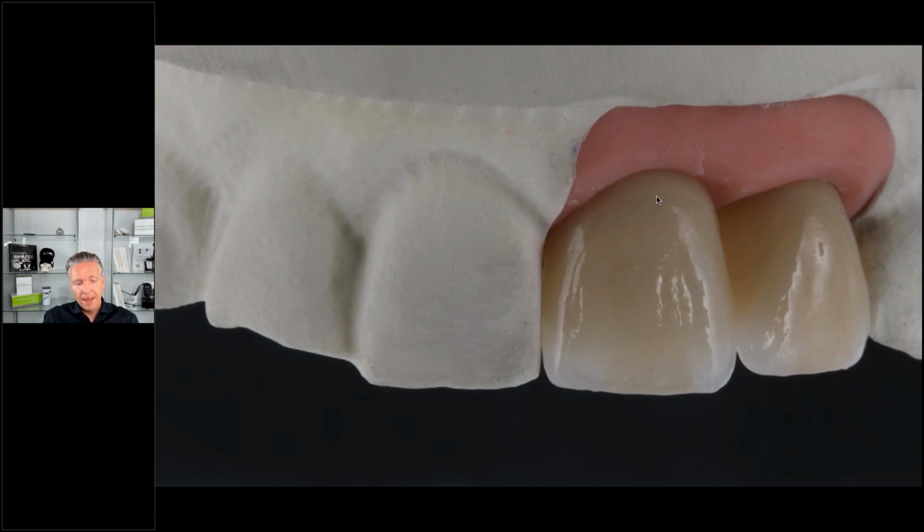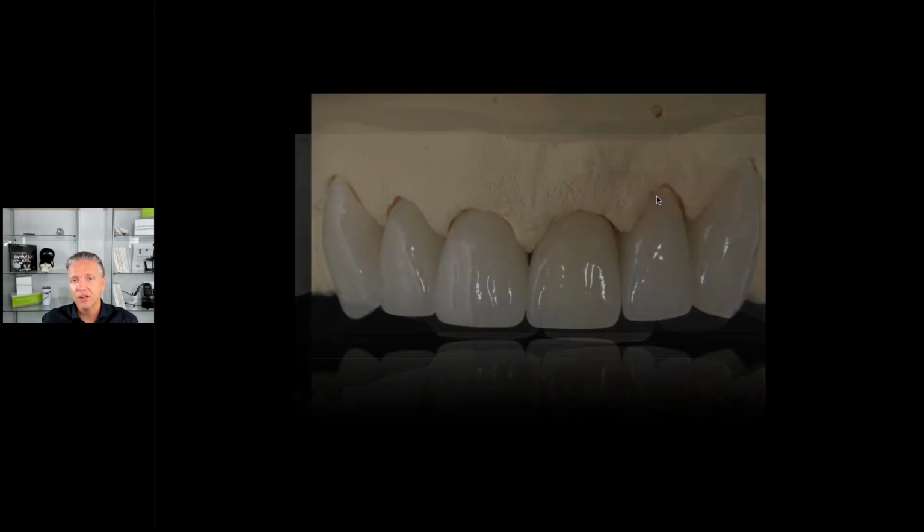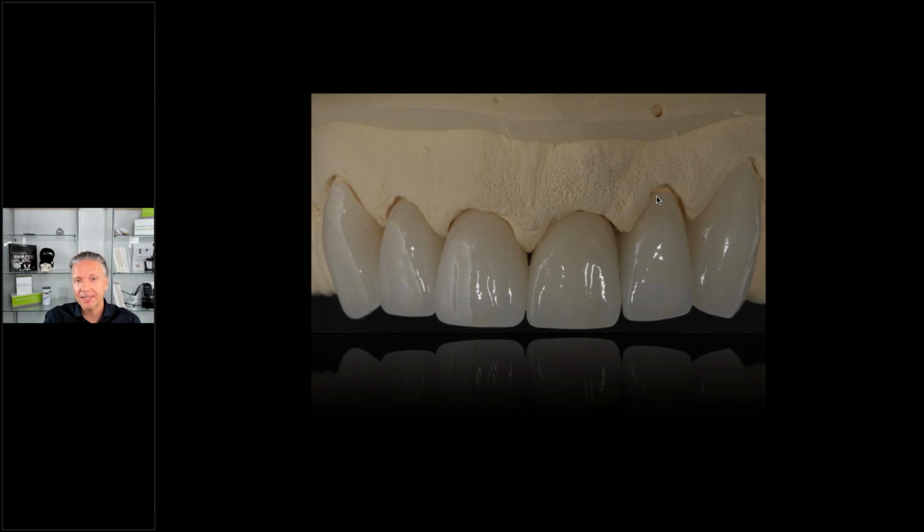So if I, for example, have an iTero scanner and I'm getting iTero models, they are milled. Then I have to definitely ask the doctor for a good photograph of the texture with good lighting, so that I understand how that adjacent tooth looks. Or I maybe have to print a study model with a printer to get a little bit more information about the anatomy of the adjacent teeth and of the tissue. It just has some more information, and I'll show you this in a second. Or I'm asking the doctor, hey, can you still take an alginate just to get information about the model?